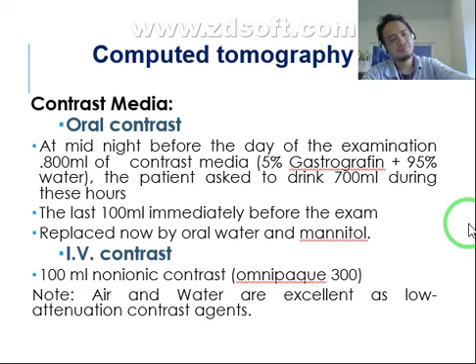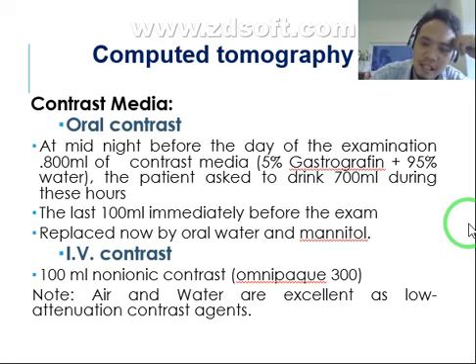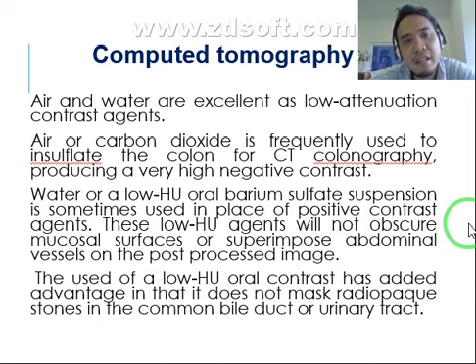So kung wala may oral suspension, pwede mo maggamit ng water because it is a low attenuation contrast agent. Especially, pwede po air using carbon dioxide. Again, air and water is excellent as low attenuation contrast agent. So air or carbon dioxide is frequently used to insufflate the colon for CT colonography, producing a very high negative contrast media. Water also has a low HU.